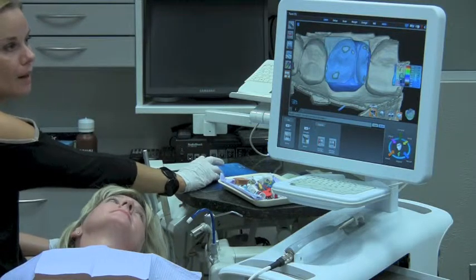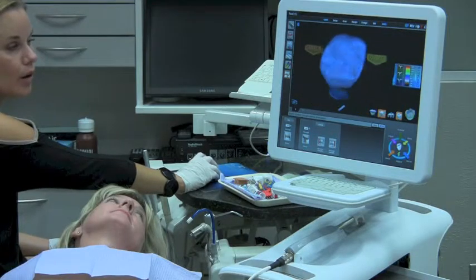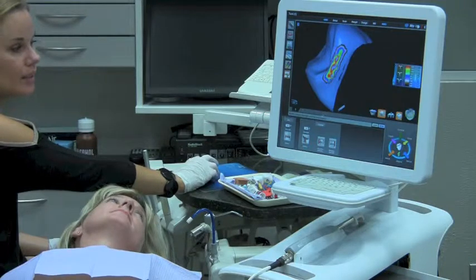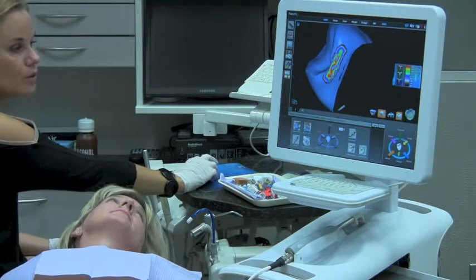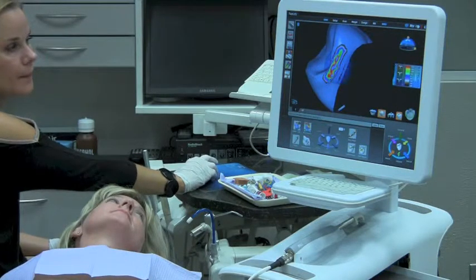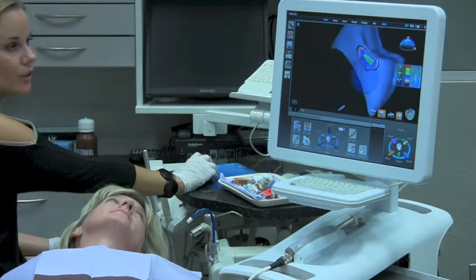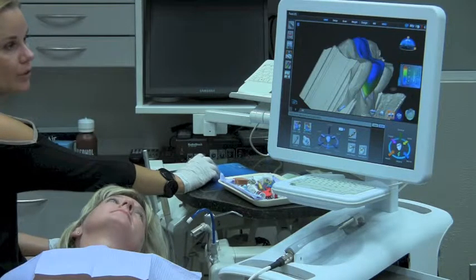When I'm happy with my occlusion, we're then ready to check our interproximal contacts. I have the ability to change them automatically, or I could also smooth them. I'm happy with the distal — we'll take a look at the mesial. The mesial looks really good. So now I'm going to check my material thickness.